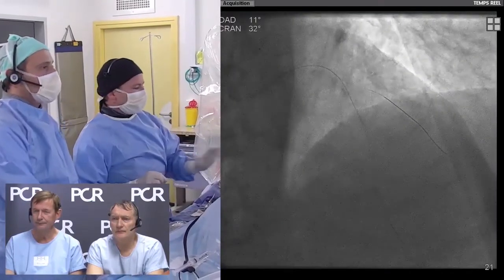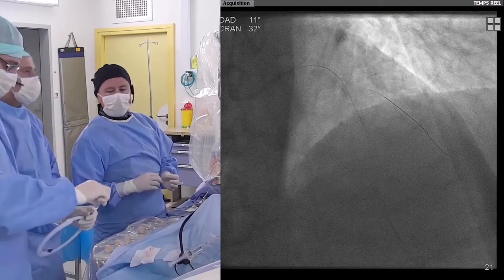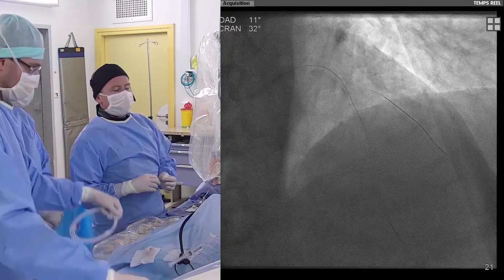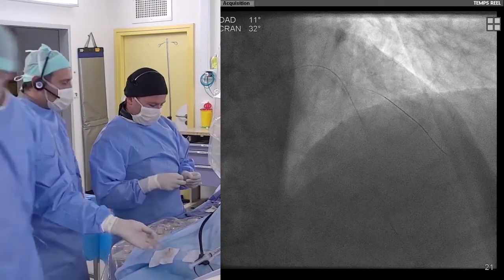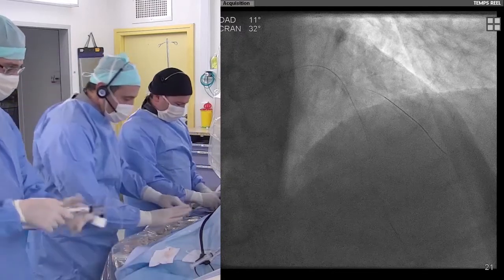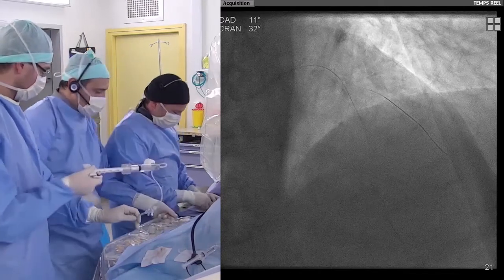We perform small injections to avoid any damage in the left main. And I quite like the fact of having the rota wire still in place, because it helps improve support and pushability of our balloon, by the way. And it will work a little bit as a cutting device, like a screwing, and also to deliver the stent.